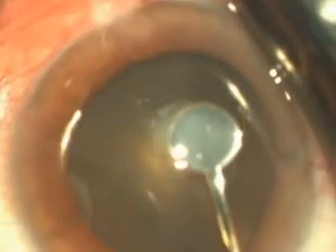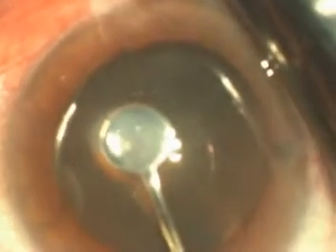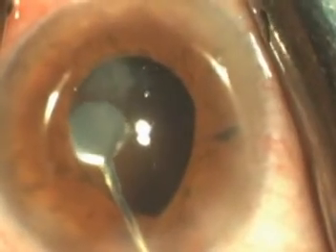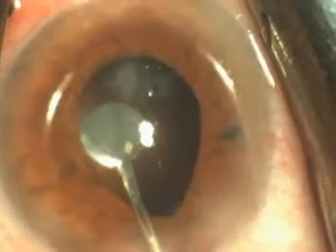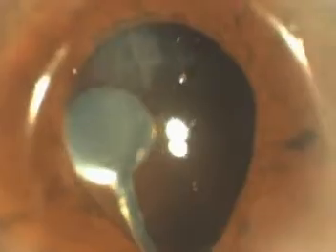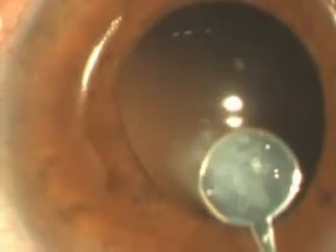Another phenomenon was noted during cataract surgery when using the intraocular mirror. This is the corneal endothelial surface of a 75-year-old patient at the beginning of cataract surgery. This is the same endothelial surface at the end of the surgery. Multiple irregular patch-like lesions, which seemed to be endothelial cell damage, were visible on the endothelial surface after phacoemulsification.